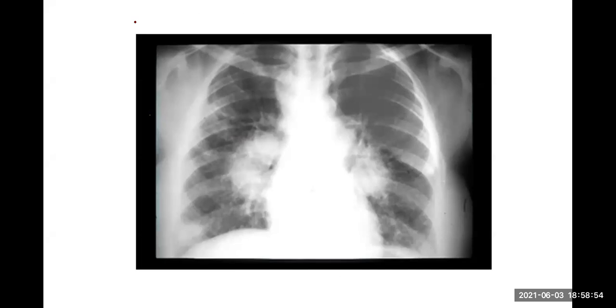Right. Okay. Now let's focus on the heart and the hilum. Heart and the hilum. Write another H after the D for hilum. Heart and hilum, cardiac is an H. This is just hilar lymphadenopathy. You don't see this very commonly. It occurs in lymphoma and sarcoidosis. Lymphoma and sarcoidosis.